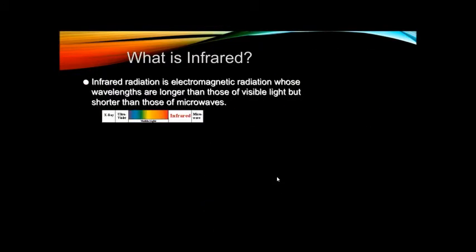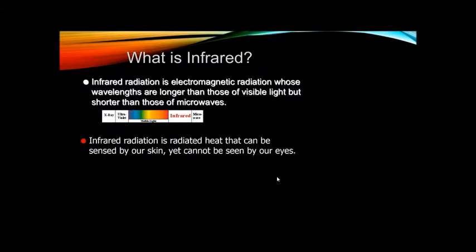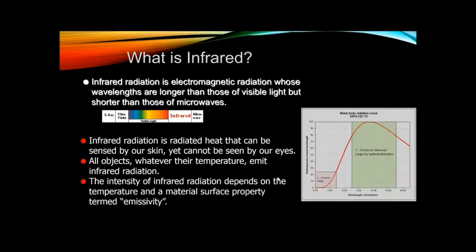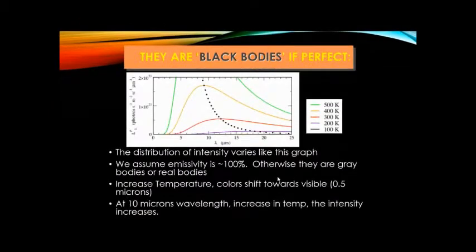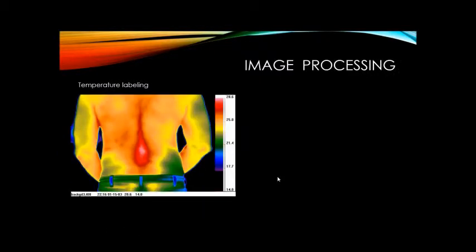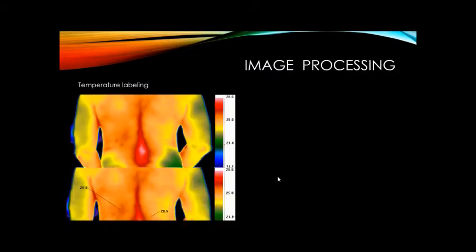The infrared wavelength range of interest is about 7 to 13 microns and is vital to understanding the relationship of infrared imaging to temperature measurement of humans and animals. An overview of scientific points are presented in this program. Learn about a blackbody reference and the distribution of the intensity of light in the infrared portion of the spectrum. The more you understand, the more confident you become with equipment selection and use of the technology.